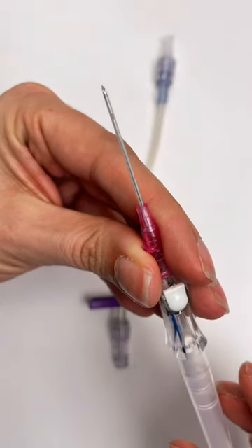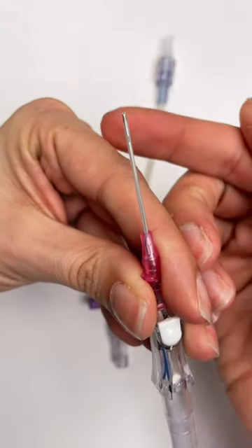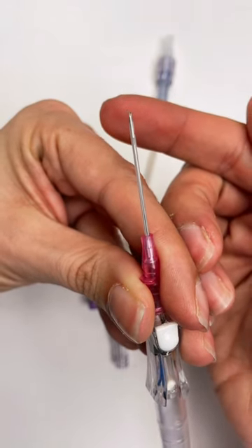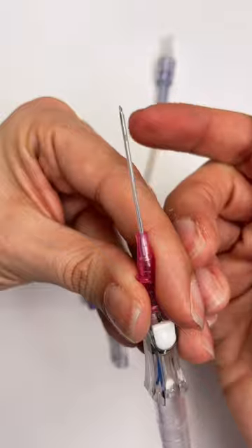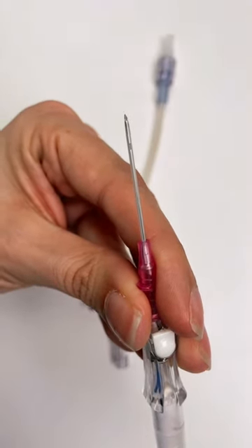So when you first see flash, what you are actually seeing is blood entering through the bevel of the needle right here, meaning that the needle has just pierced the vein, but the catheter is not yet fully seated within that vein. Let me show you.